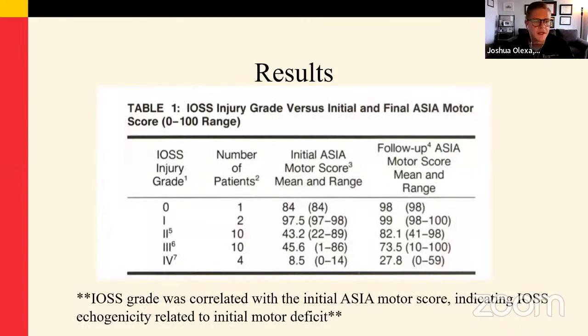So again, they had 30 patients that they looked at, and they noted first when they were reviewing their results following these patients that the parenchymal spinal cord lesions that they saw at the level of fracture or stenosis were compatible with the initial neurologic deficits that they detected on intraoperative ultrasound in the patients presented with clinically in almost all of the patients. They really quoted about 29 of the patients with technically adequate studies. I think there was one patient they said they couldn't actually see it based on the fact that the ultrasound wasn't giving them adequate data.